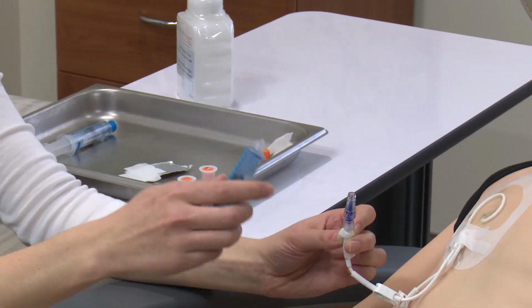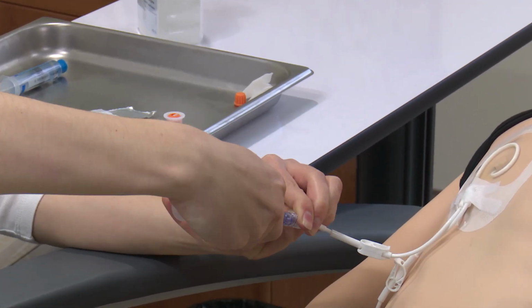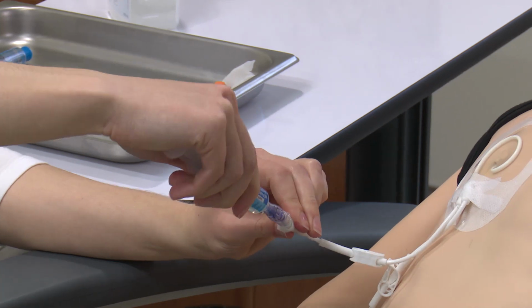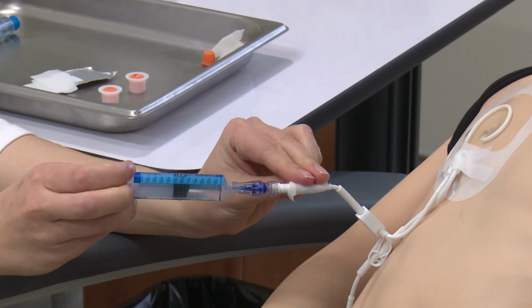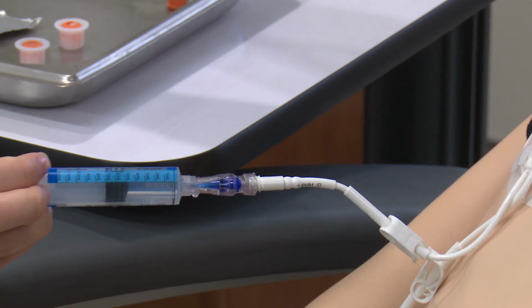Remove the cap off the heparin syringe and attach the heparin syringe by twisting it clockwise to the right onto the end of the cap. The amount of heparin you will use is based on your child's weight and type of line they have. Confirm the amount of heparin you will use now.